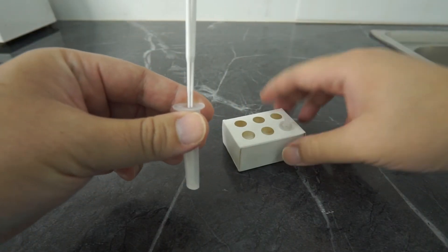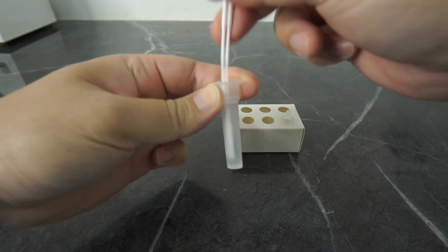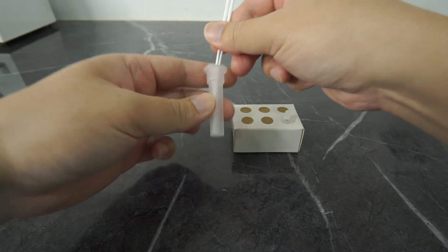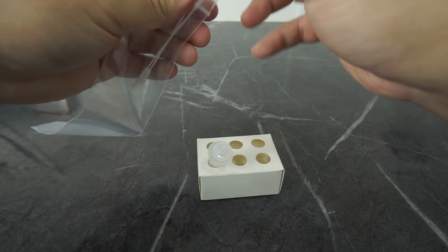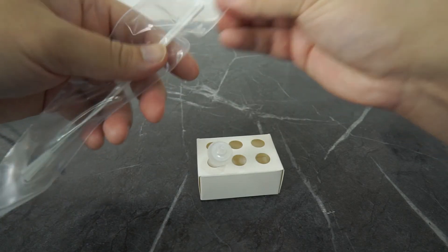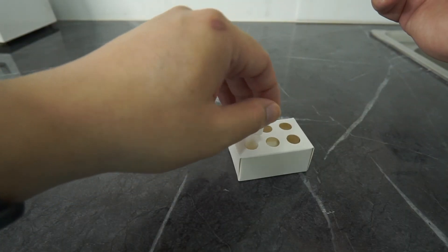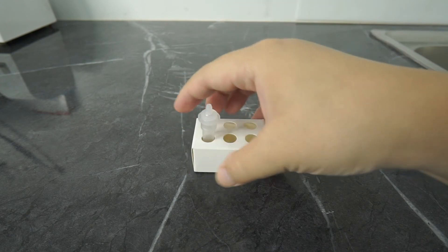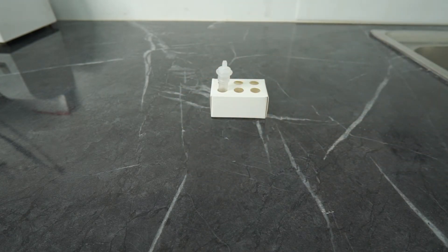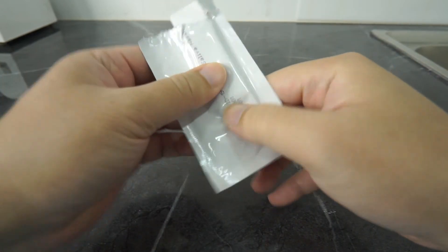Immerse the swab heads into the extraction buffer completely and vigorously mix at least 10 times. Before you remove the swab, squeeze the liquid from both swabs to keep the solution in the tube as much as possible, then discard the swabs. To dispose of used swabs, put them in the waste bag provided and seal the zipper completely. Cover the tube with the dripper head firmly and mix the sample solution thoroughly. Note that testing should be performed immediately after specimen collection, as samples are stable for only 30 minutes when kept in the extraction buffer.